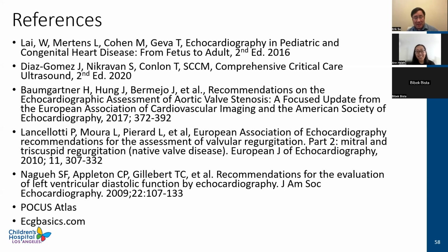And for diastology, it's really interesting. I know that there's tons of people who don't even know how to turn tissue Doppler on their machines, but there was some retrospective work by Lanspa looking at diastolic dysfunction, in studies done both through comprehensive echo and by POCUS folks, who found that diastology tended to find markers that portended mortality more so than systolic markers did.